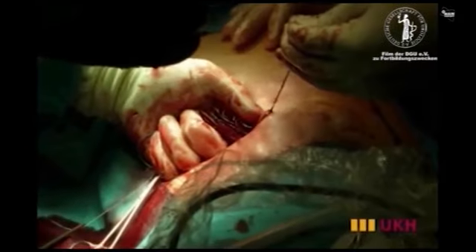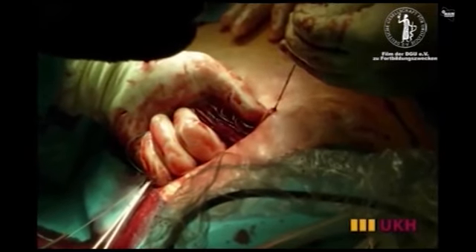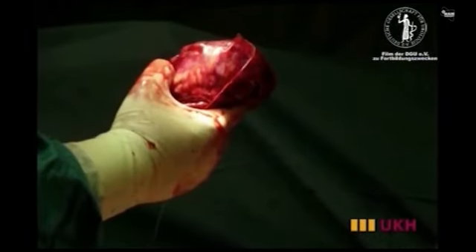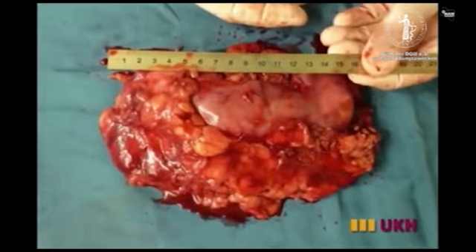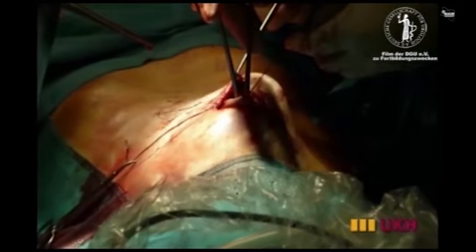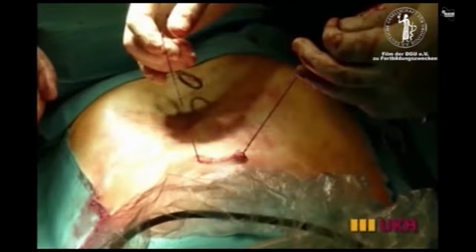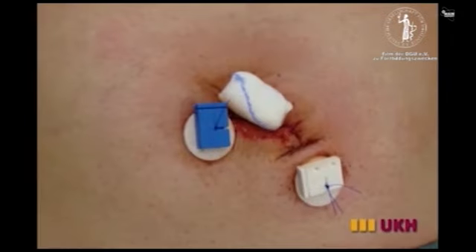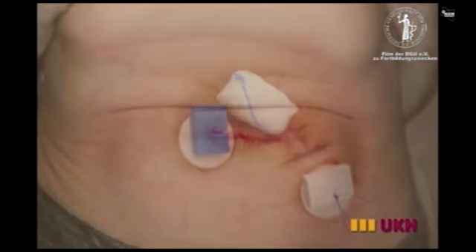Using the bigger port of the endocon, an endocatch bag is introduced into the abdominal cavity. For specimen removal, the rectus fascia incision is extended in a cranial and caudal direction, and the intact specimen is removed through the umbilicus, without morcellation. No drainage catheter is placed. The fascia is then closed with interrupted 2-0 vicryl suture, and the skin is approximated with an intracutaneous suture.